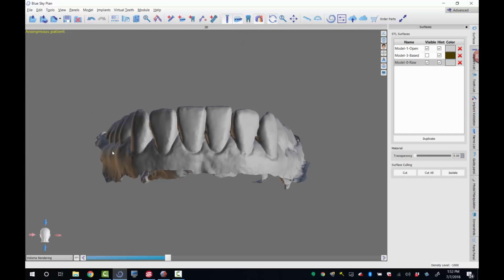So real quick, I'm just lining these up, the gingival zeniths. Bring my mouse over here, go a little bit below that, press the shift button, draw down and around. It's going to be like a lasso. And now I can take the flat part up to where I want it. Now I'm getting a little bit heavy-handed on that gingival margin below number 22, that lower left canine, but for this video I'm okay with it.